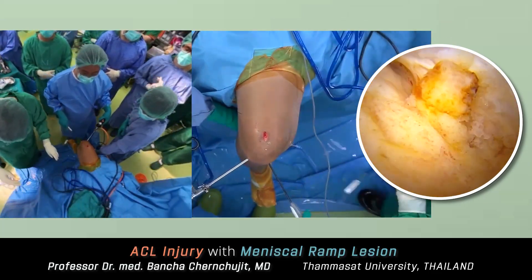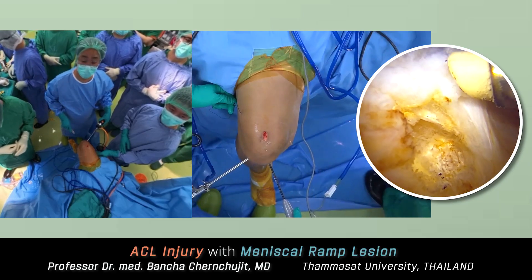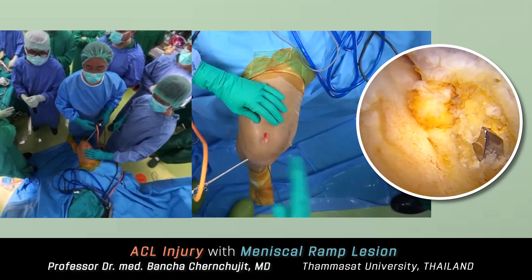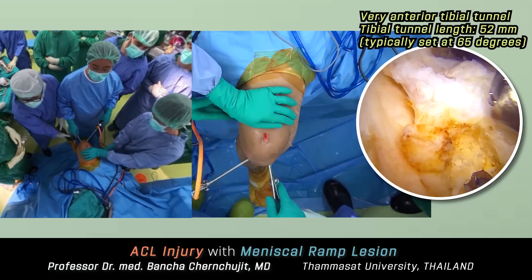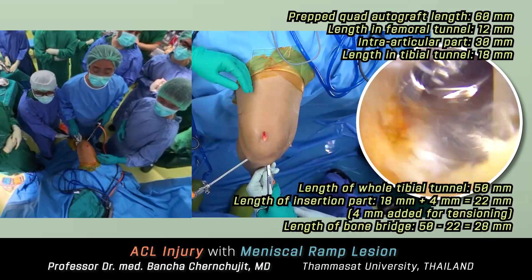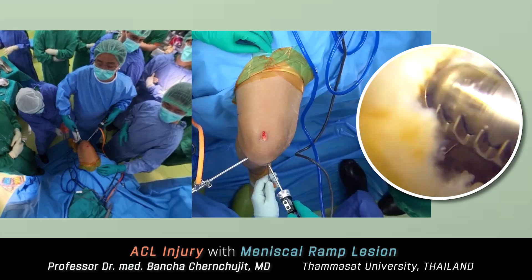Next, I will create the tibial tunnel, positioned very close to the tibial spine — more anterior than previously. Since we tend to have short tibial tunnels, I set a steep angle of 65 degrees, resulting in a tunnel length of 52 millimeters. My tibial tunnel is quite large, about 10 millimeters in diameter. I perform retrograde reaming of the tibial tunnel; the advantage is that you preserve bone stock because you don't need to ream all the way through, which previously resulted in more bone loss.